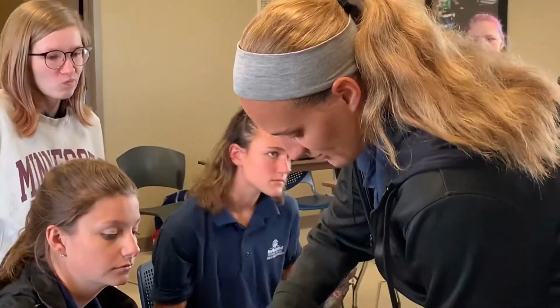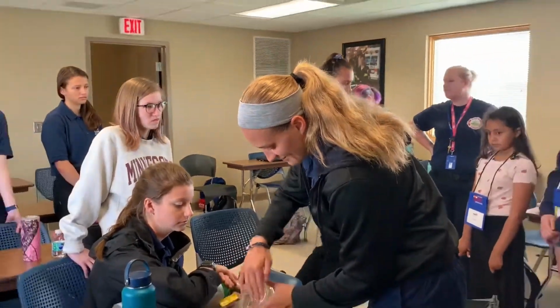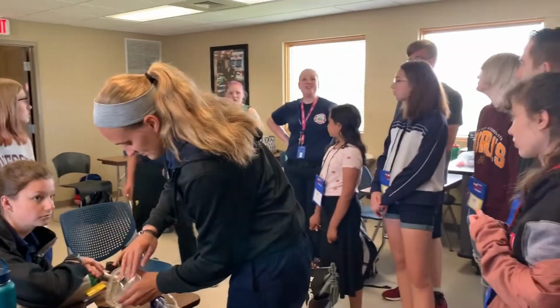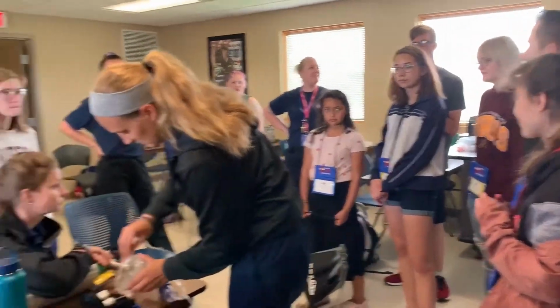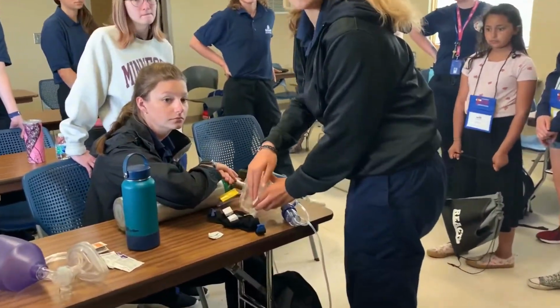So if anyone wants to try it, we'll practice and apply it. Does anybody have any respiratory issues? I don't want to put it on them and then hear they have a hard time breathing when it's all said and done. It's really not that bad. It's kind of cool.